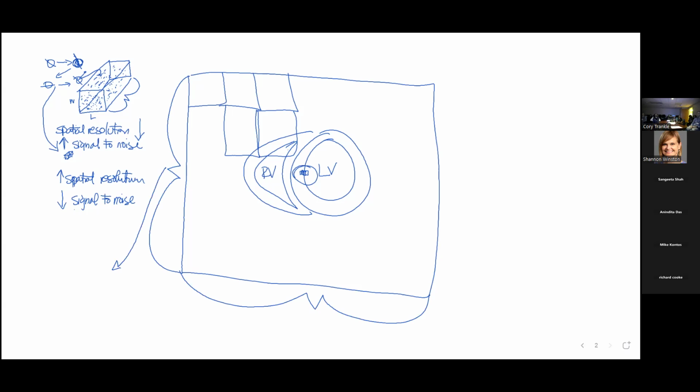Yes, the field of view. So in the world of MRI, you're going to hear this term, the field of view. And if you're sitting there at the scanner, it's going to be called FOV. So the first thing you're going to do is set the field of view.